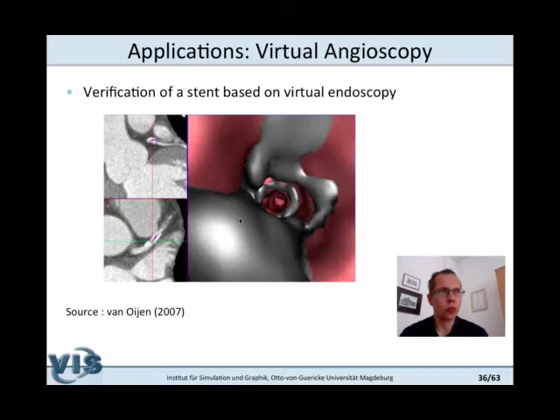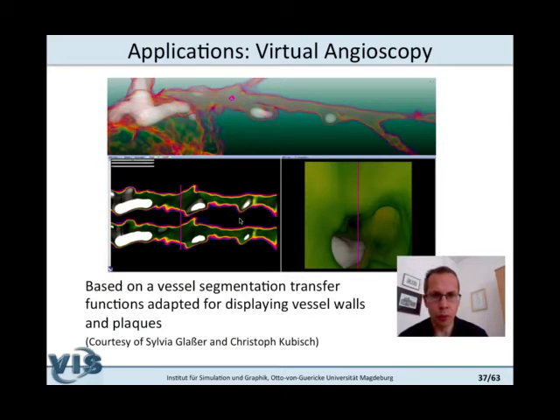Yeah. Also, after a stent, problems could occur. New stenosis can develop inside a stented region, so-called in-stent stenosis. Yeah, that's due to the interaction of these often metallic stents with the biological tissue. The material is chosen in such a way that it is quite biocompatible, as it is said. But since we are all so different, a certain material is not favorable for all patients, and you do not know this in advance. So therefore, such follow-up investigations are really important.